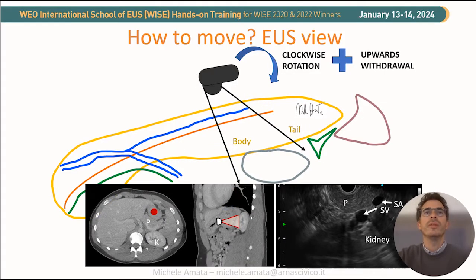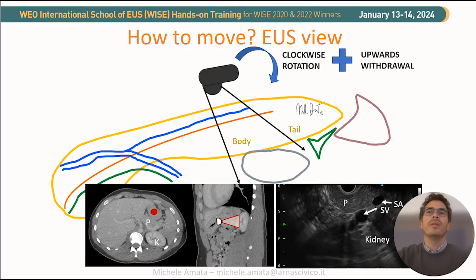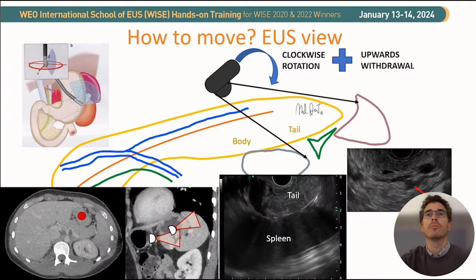Continuing the rotation and withdrawal with gentle upward movement, we will trace the body and tail, and we will also face the kidney, which is anatomically behind the pancreas and at the bottom of our image. This is the landmark of the transition between the body and the tail of the pancreas. Continuing, we will finally reach the spleen and the adrenal gland.